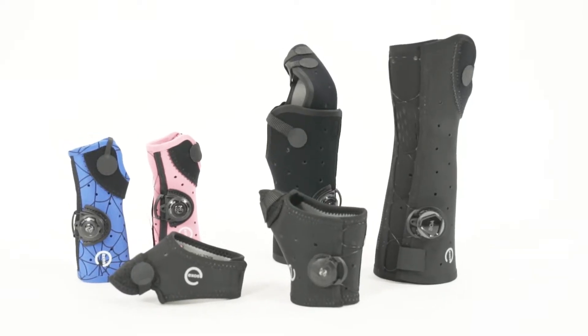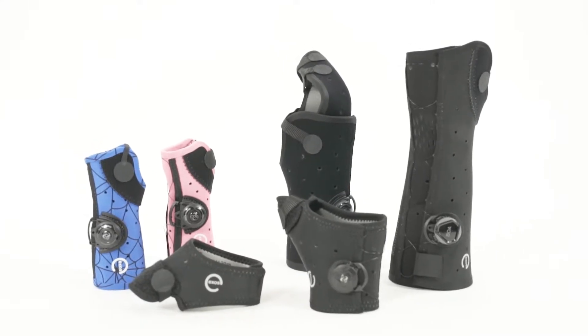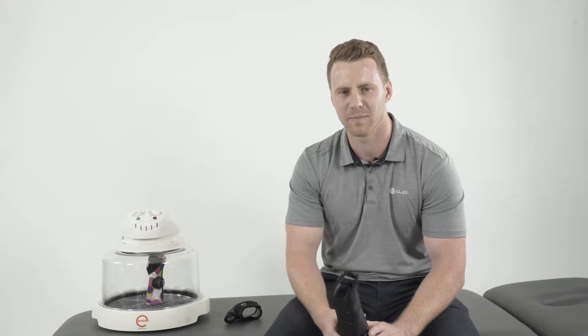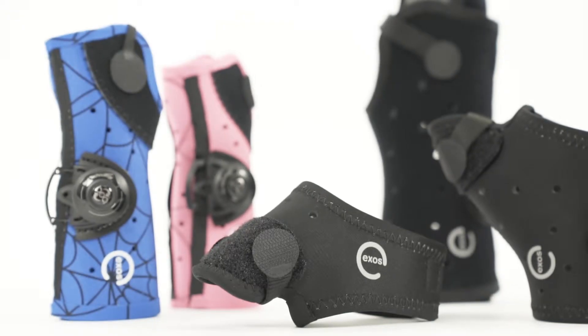Exos is a really innovative casting or bracing system for the management of upper limb fractures and other instabilities and injuries of the wrist and hand. With the Exos braces we've got a whole range of prefabricated designs that are based on the injury sites of your patient.